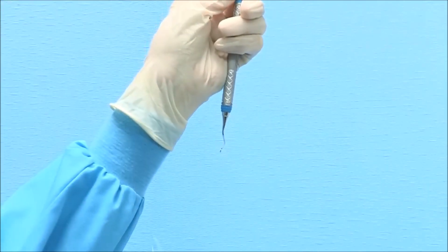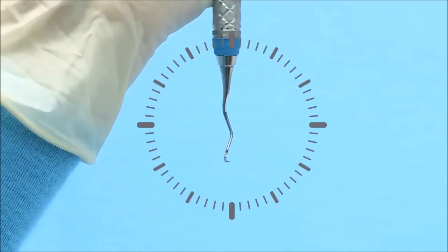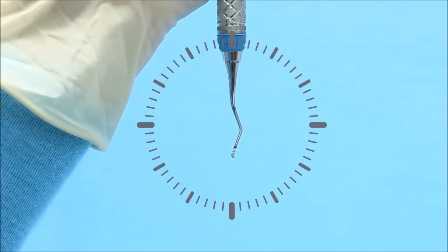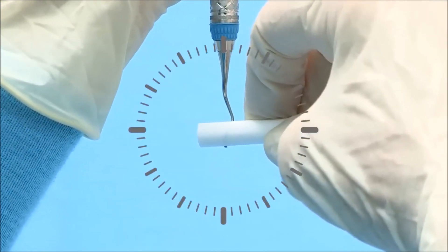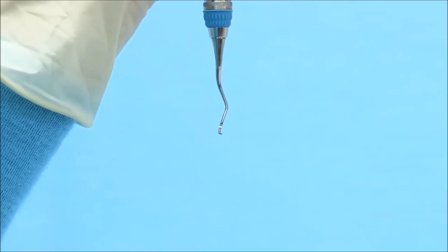To finish the facial surface of an even-numbered Gracie Curette, hold the terminal shank at 3 minutes after 12 o'clock with the toe pointed toward you. Position the cylindrical stone along the face of the blade horizontally at 3 and 9 o'clock. Lightly roll the stone along the face of the blade from heel to toe.